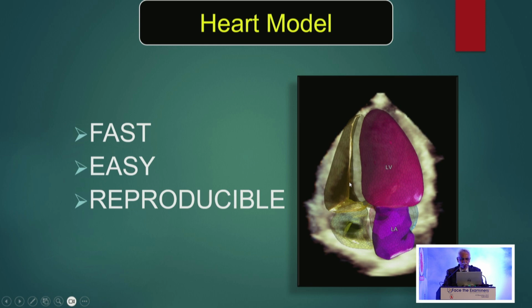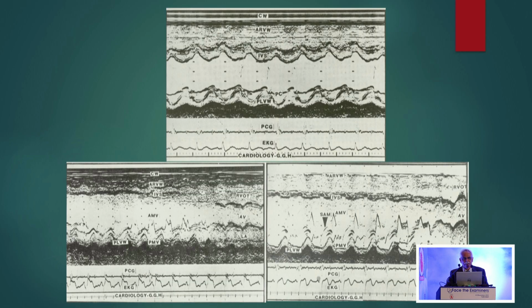The only thing you have to acquire is the pyramidal cast of the entire left ventricle by using the three-dimensional echocardiogram. When you push a button, it will immediately mark out the endocardium and calculate the left ventricular volumes. Again, there may be some errors, and it has to be supervised because these measurements depend upon the endocardial delineation. The endocardial delineation may not be so good in all patients, so we need some supervision for the assessment.